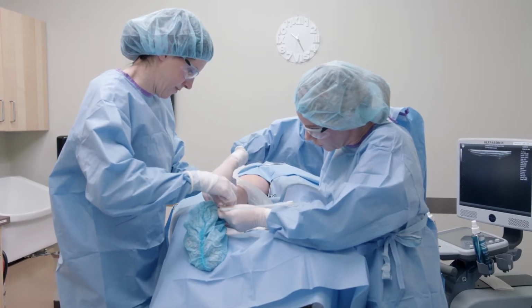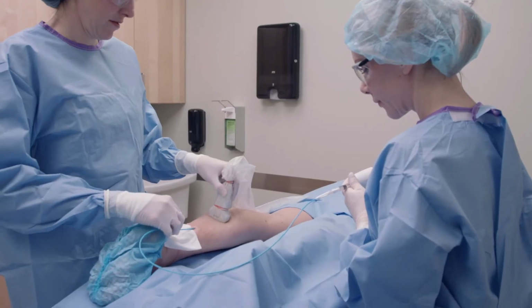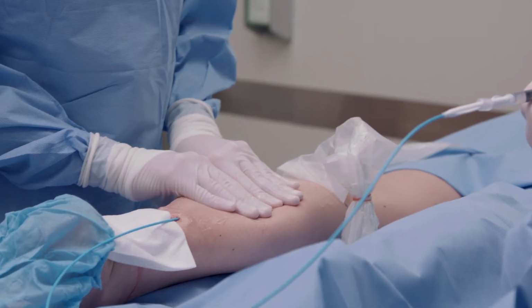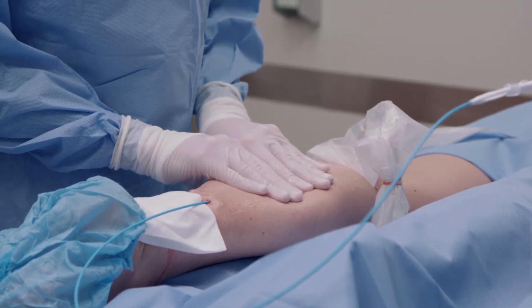Once access has been gained and the catheter is in the vein, then we're going to start actually gluing the vein closed. And this is probably a bit boring for you at this point because all you're doing is waiting as we systematically pull the glue tubing out and deposit small aliquots of the cyanoacrylate into the vein and apply pressure. The longest time for pressure being held is at the very top, where we hold it for 3 minutes. After that, each section every 3 centimeters is about 30 seconds of pressure on the vein to make sure those vein walls are totally in contact with the cyanoacrylate glue.